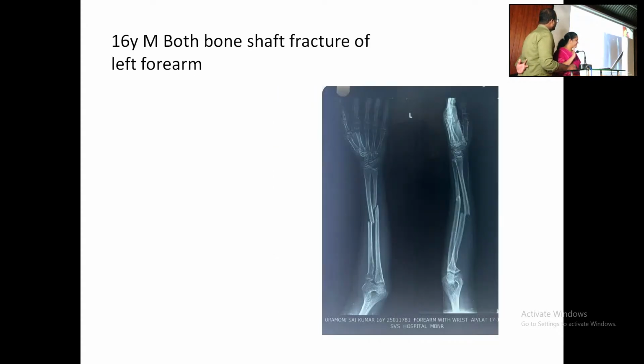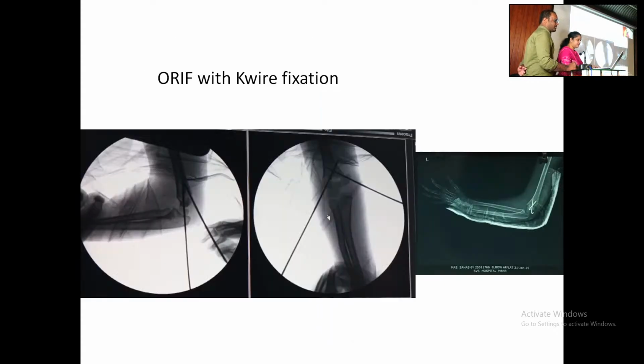Is there any rotation deformity? Where, sir? Is there? No, the previous X-ray. Is there, sir? Rotation deformity. How do you know there is a rotation deformity? The width is different.